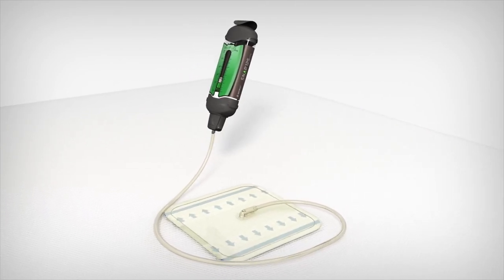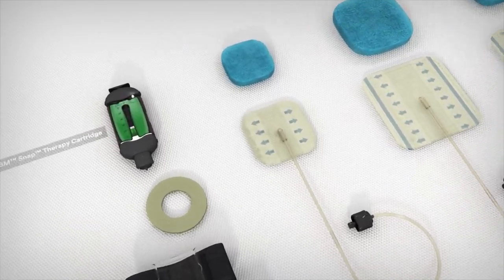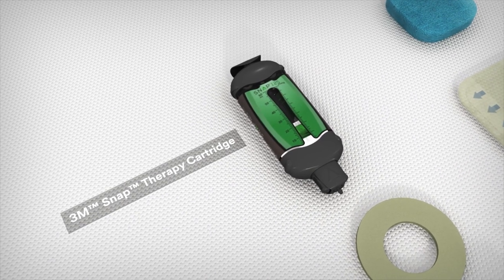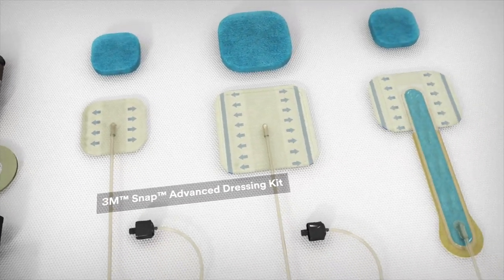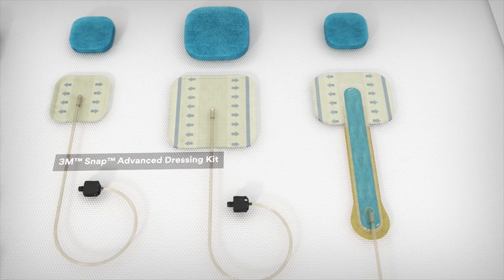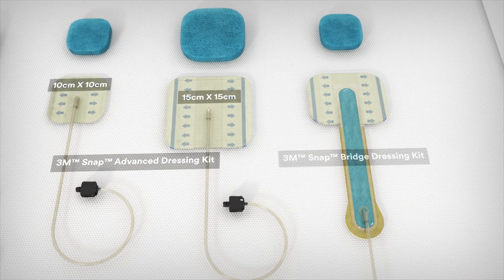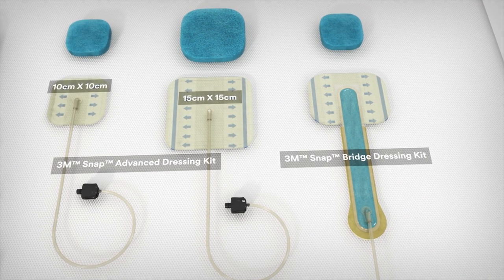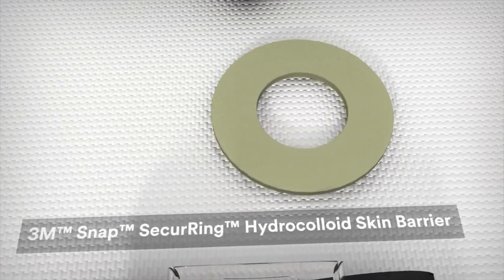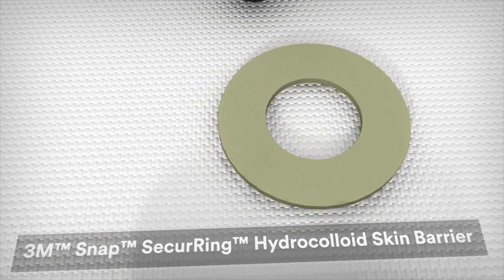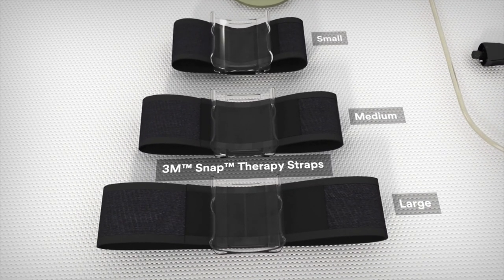SNAP therapy is also easy to apply. Before beginning, select the 3M SNAP therapy cartridge and the 3M SNAP dressing kit you feel is most appropriate for your patient. The 3M SNAP advanced dressing kits are available in a variety of sizes, including 10 x 10 cm, 15 x 15 cm, and the 3M SNAP bridge dressing kit. The 3M SNAP securing hydrocolloid skin barrier may be utilized to help create a seal. 3M SNAP therapy straps are available in three sizes.